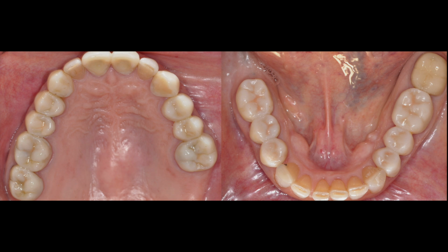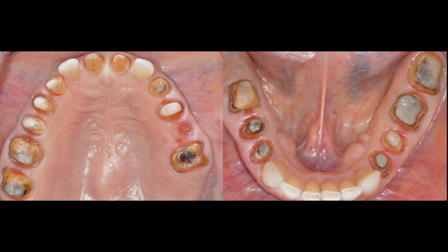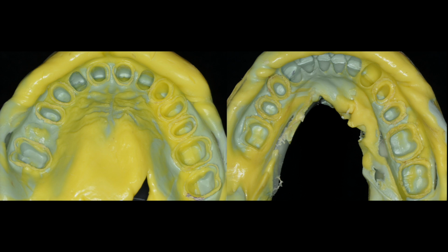It's all about that soft tissue management from the restorative perspective. This is our challenge as restorative dentists. And those provisional restorations can serve as an excellent tool for managing that soft tissue. So once the tissue is healed enough, we can go ahead and remove the provisional. The patient functioned with those provisionals for several months. We want to know that the patient is comfortable, and then we're ready for our final impressions.